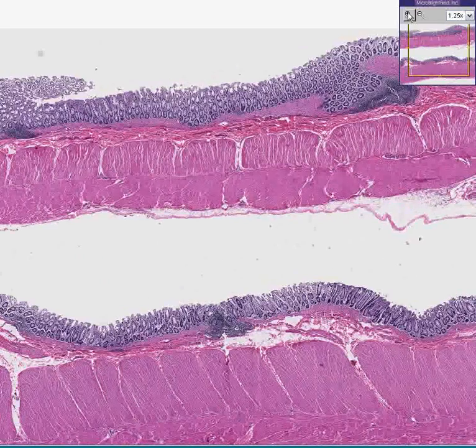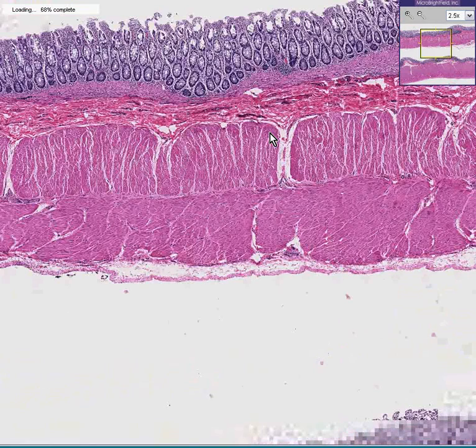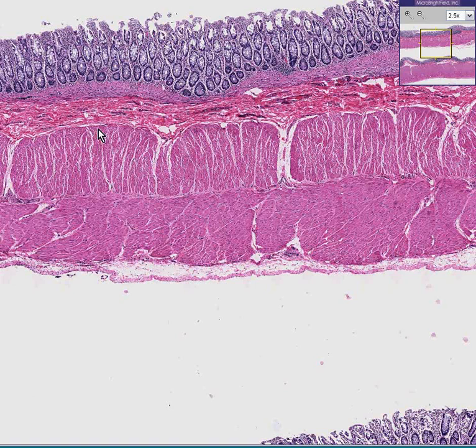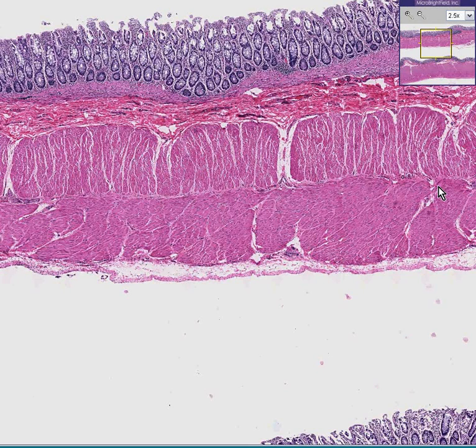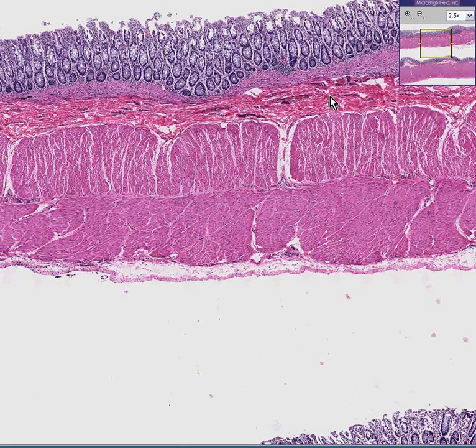Not really, though, because if you look closely, the one thing you frequently don't look for in a normal colon are the little things that you just ignore — and those are the ganglion cells. You should remember that there are two areas in any part of the gastrointestinal system, including and especially the colon, in which we have ganglia. One is in the submucosa of the colon, and the other is the so-called myenteric plexus between the circular and longitudinal layers. The myenteric plexus of Auerbach is usually easier to find, and sometimes you have to look a little bit harder to find the submucosal Meissner's plexus. They are ganglion cells — like the intrinsic brain cells of the bowel. They can operate completely independently of central nervous system control, and when we were all worms, that's probably where our brains were, inside our colon.